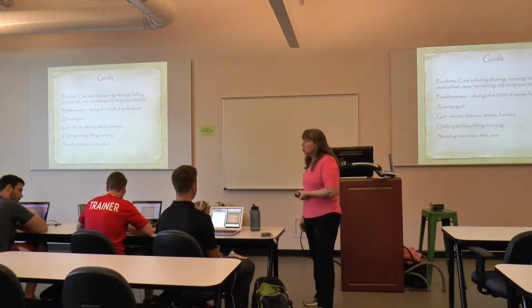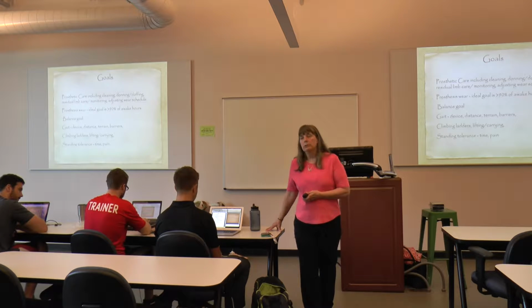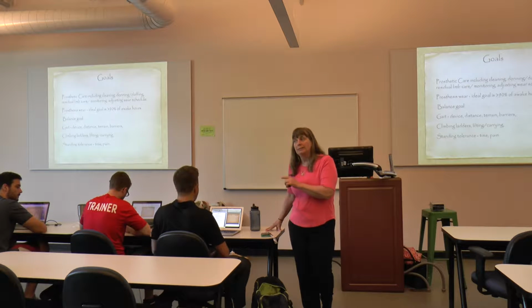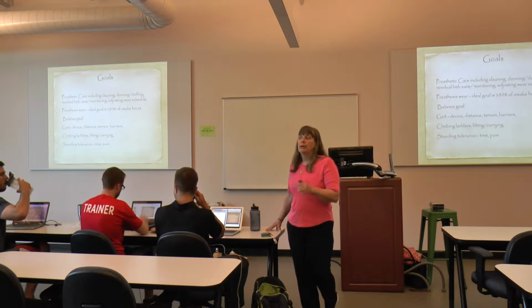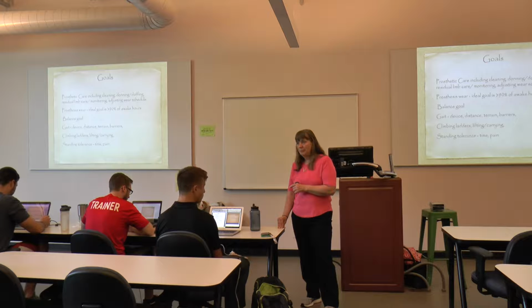Okay? My short-term goal may be hours though. So the patient is able to tolerate wearing the prosthesis greater than 8 hours total per day. And the reason the total goes in there when we talk about wear is a lot of times I do twice a day wear. I wear it for so many hours twice a day. So I say greater than 8 hours total without skin or limb pain issues. Okay?